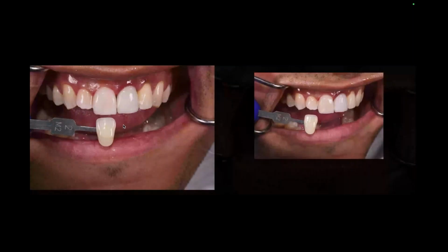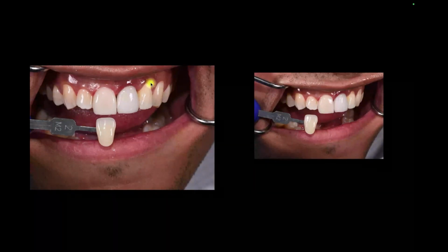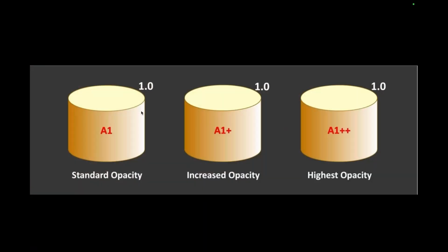In truth, this is that same white ingot. And now look at it next to that natural tooth, right? So you think I might have been too bright? I'm not sure I'm going to be bright enough on that number 9, because I'm really going to need that white ability. And then I can stain down and add chromas and powders on top of that to finalize it.